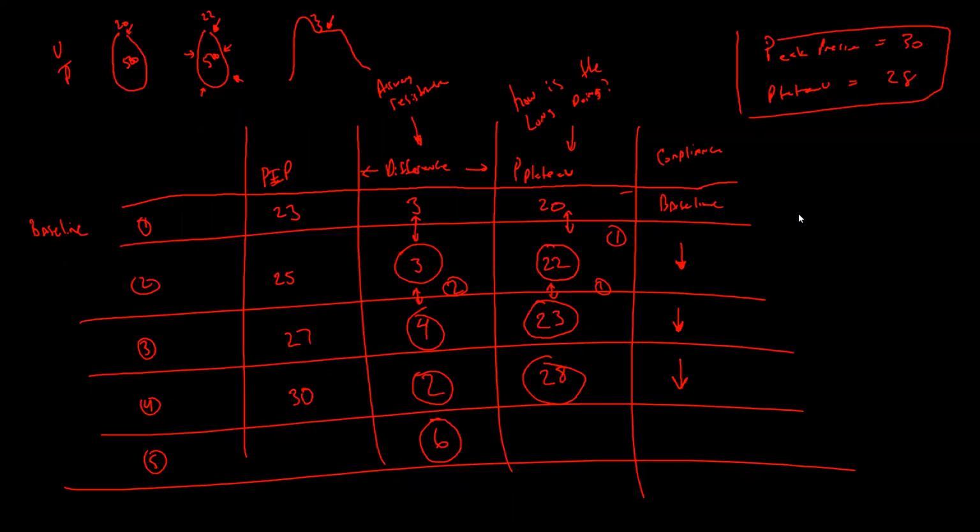Do they increase, decrease, and what happens? And it'll have 4 different ones, and you have to pick out what it's doing by the verbal, not just a chart. They'll do it verbally and they do a chart, and yes, that's how they do it. Good. So pay attention to the relationship here. If your plateau pressure is going up, your compliance is going down.